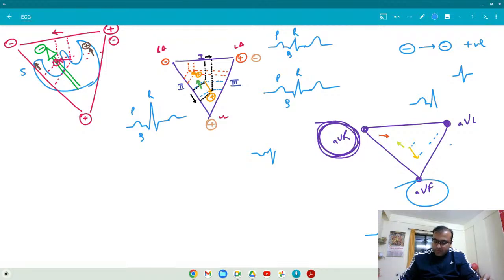AVF is entirely positive. Correct, big positive, yes, very good, it will be a big positive. Okay. So this is about the AVR, AVF and the AVL. So fine, I'll give you 1 minute time. Okay, let's finish it off.